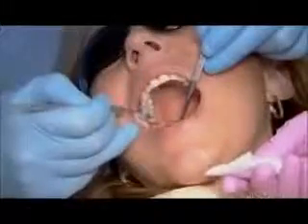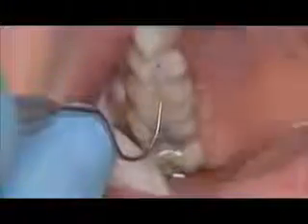Next, he adds a drop of silane, which will promote the bonding of the inlay to the tooth. The dentist injects tooth-colored resin cement into the cavity. He presses the digitally designed and milled inlay into the cement, then scrapes away the overflow. Halogen light on the dental work hardens the cement. He takes another impression of the patient's bite to confirm the new inlay is perfect.